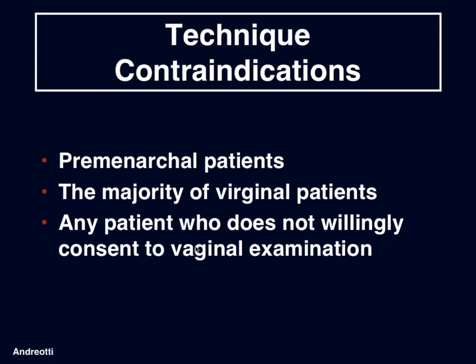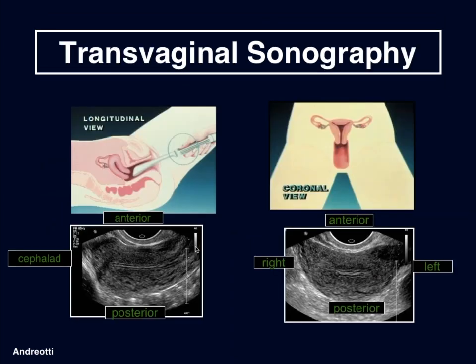This technique also involves certain contraindications. First, we would not perform this study in premenarchal patients, in the majority of virginal patients, and in any patient who does not willingly consent to the vaginal examination.